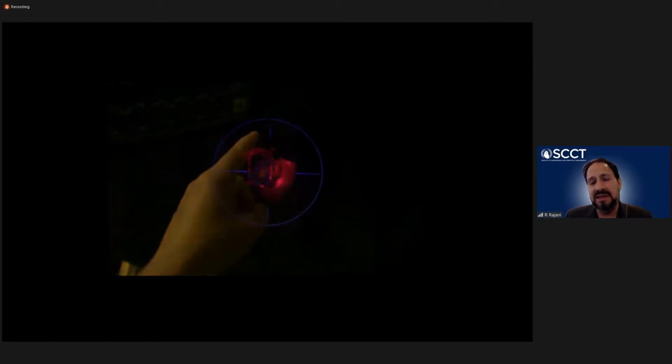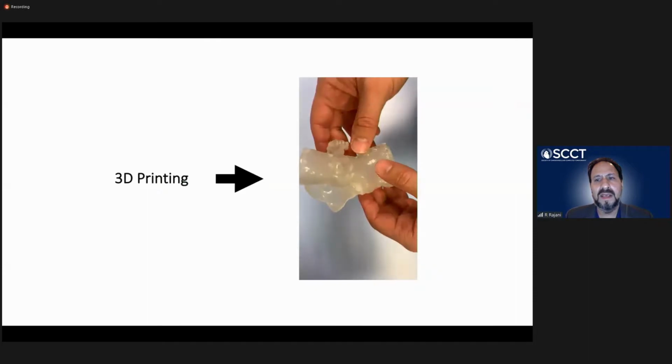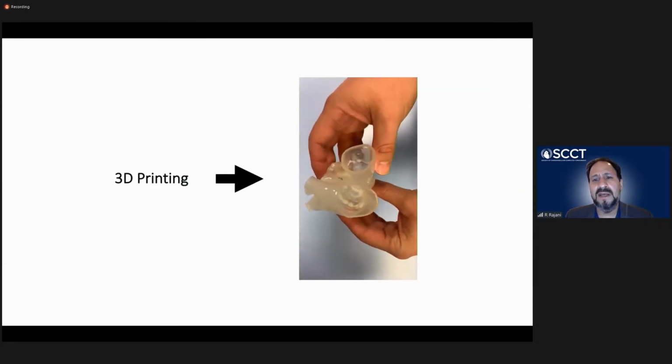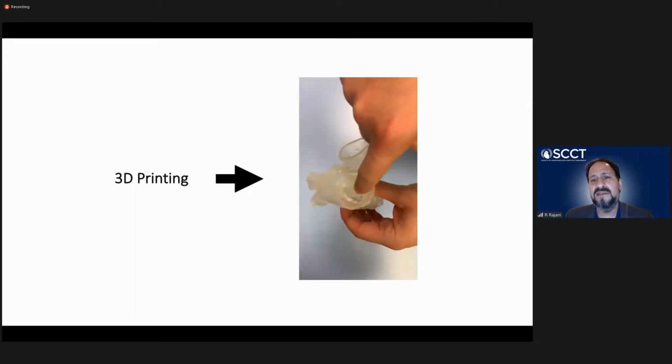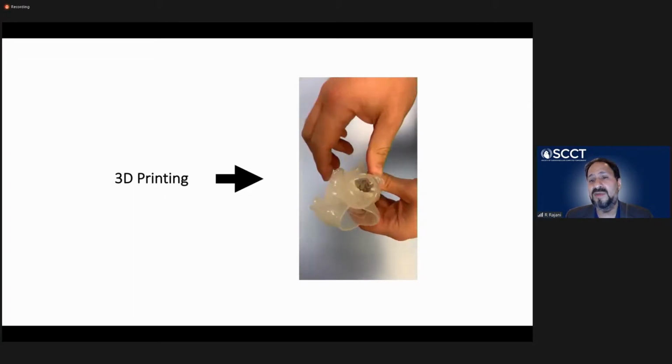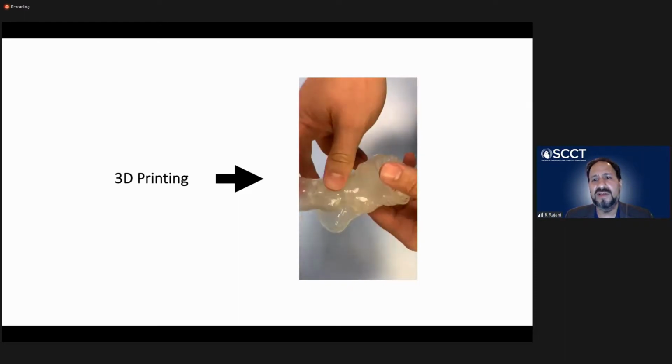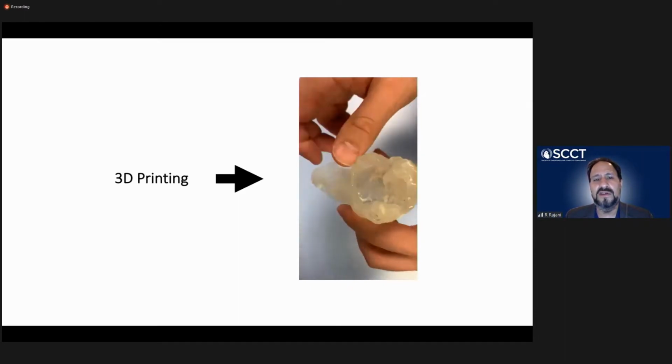So this is a hologram that is projected into the air using a specific platform. So we have all of the anatomical detail available. And clearly there is the role of 3D printing. Currently we use 3D printing where we feel there's going to be high definition information that's relevant, in particular for complicated cases for our interventional cardiologists or indeed surgeons.